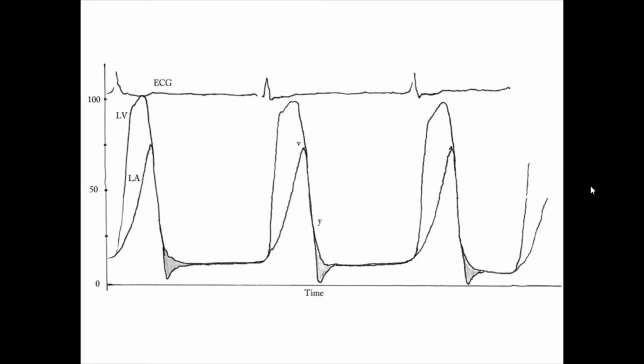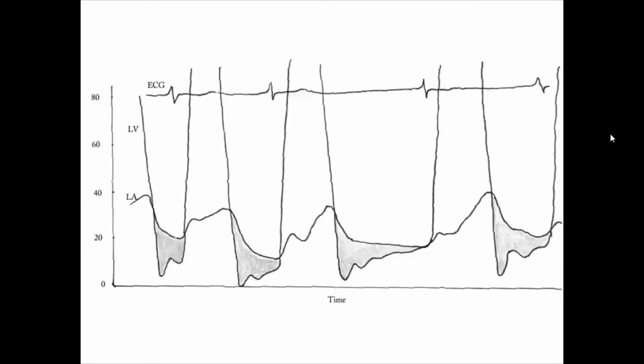So LVEDP is not elevated. So this is most likely isolated severe MR in a patient with atrial fibrillation. Excellent. Well done. Okay. So who can take this one?